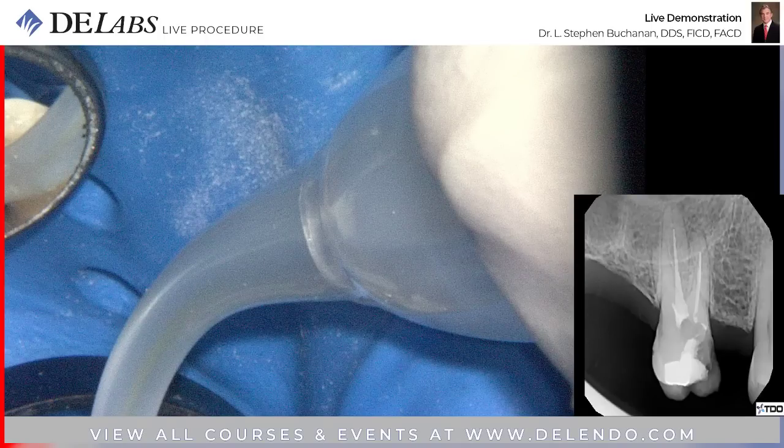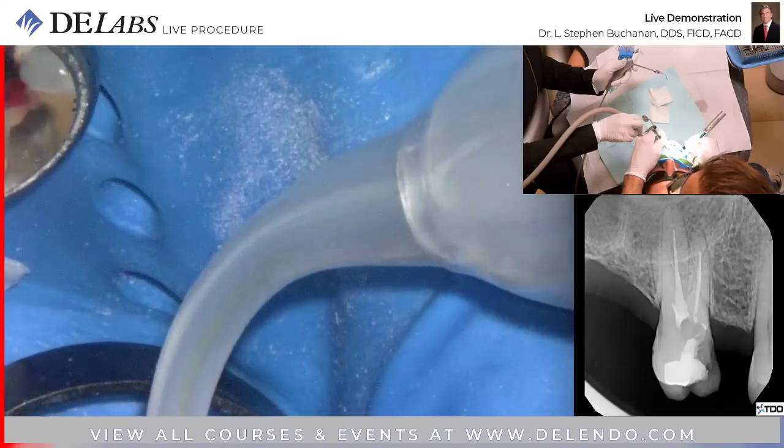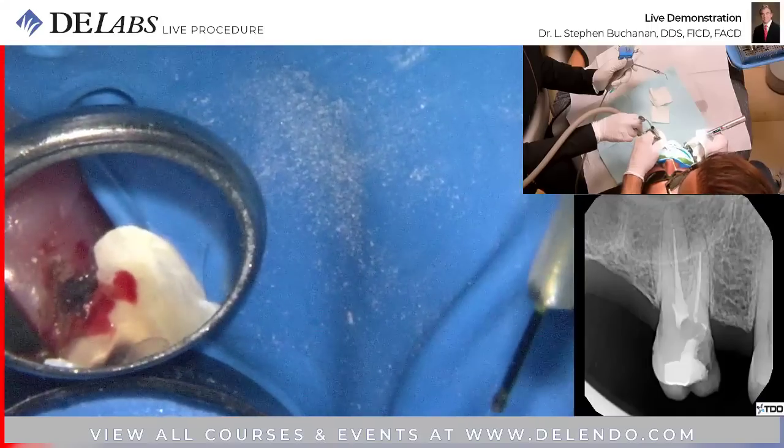About a millimeter away from the surface of the tissue is ideal. Wash.